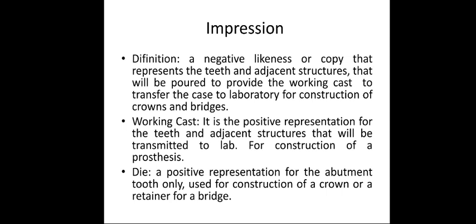The die is the representation of the prepared tooth only. The die, when we cut the representation of the prepared tooth in the working cast, it will be called the die. This is used for the delicate and the precise construction of the restoration.